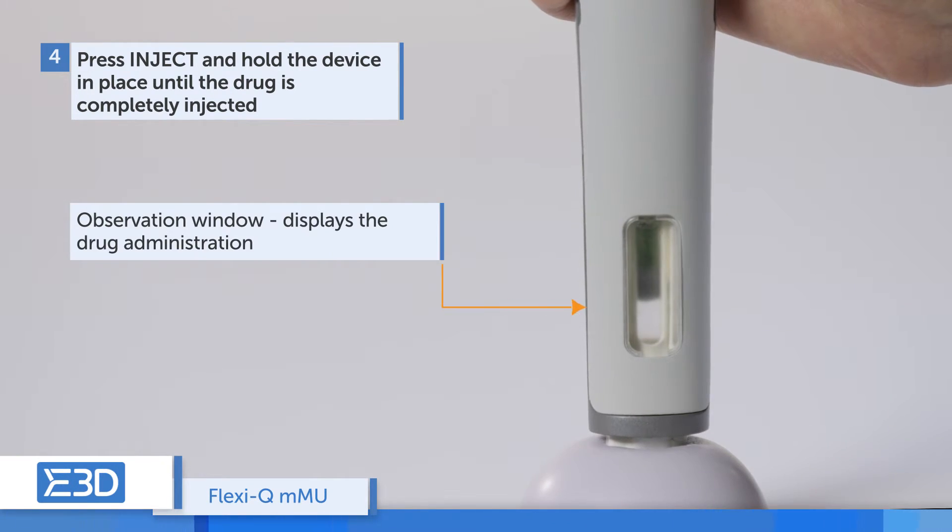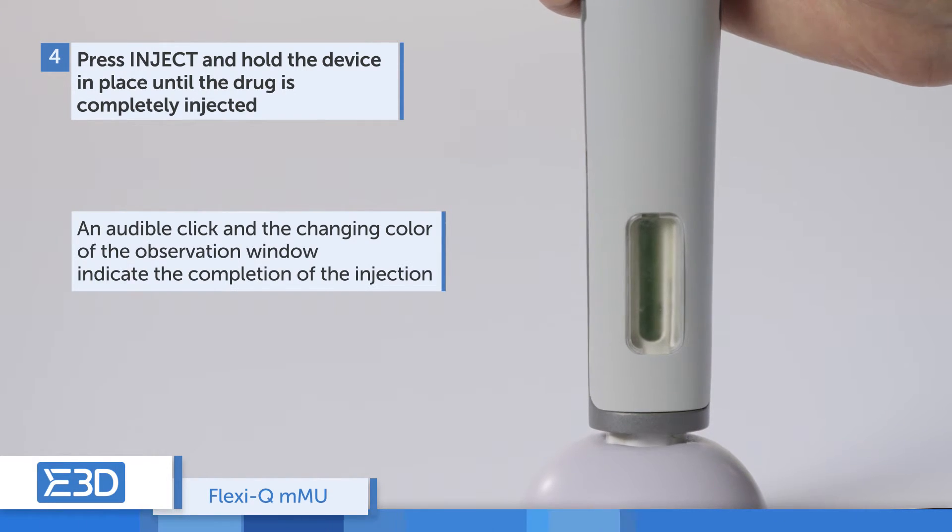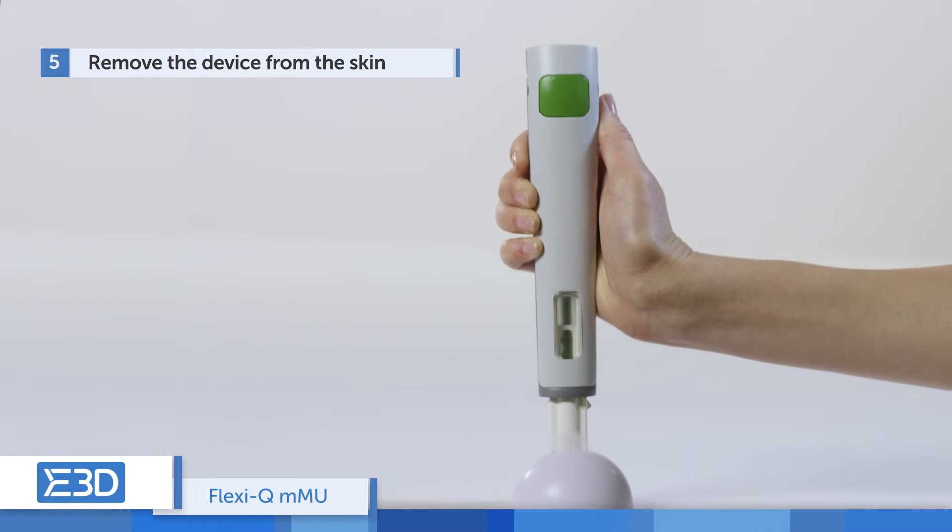The drug administration can be seen through the observation windows. An audible click indicates that the injection is completed. Remove the device from the skin.